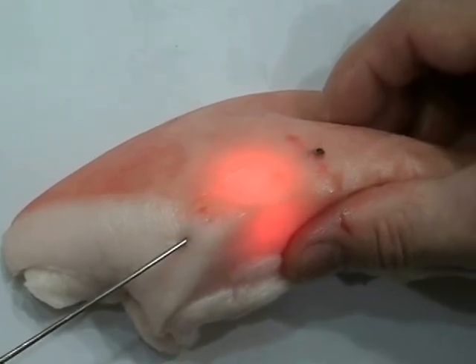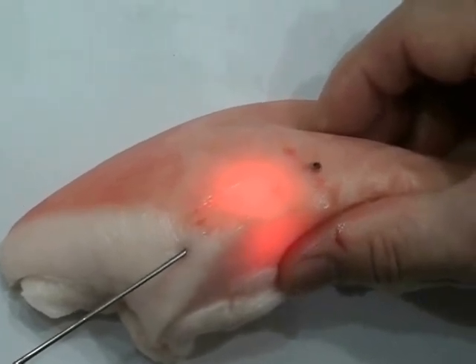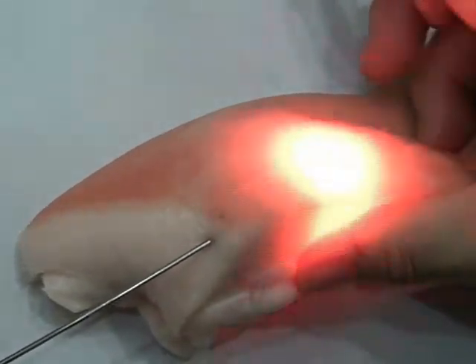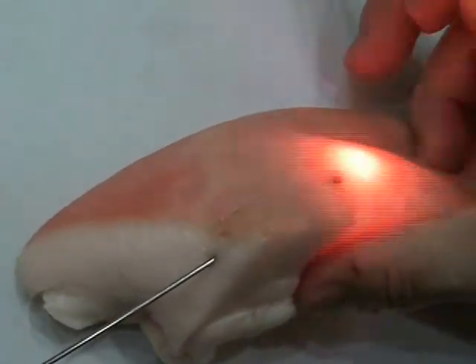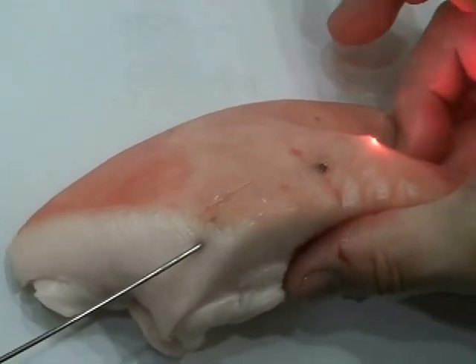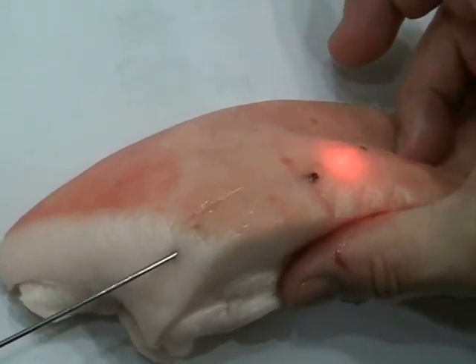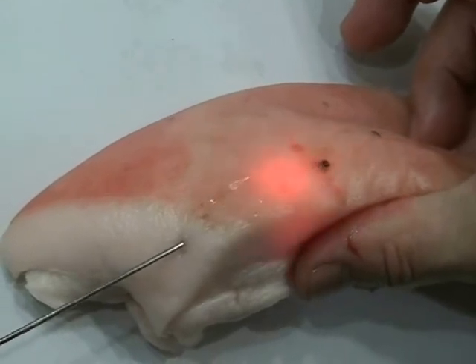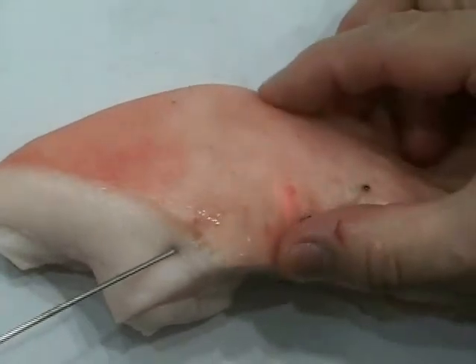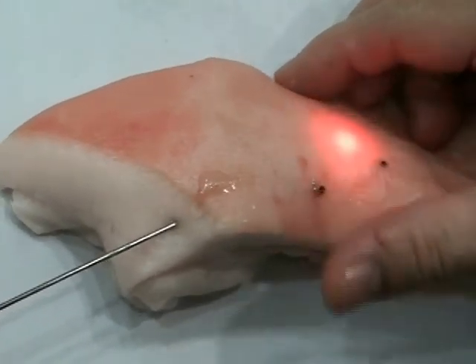If the operator moves the handpiece forward while emitting plasma light, the same as in the common laser lipolysis procedure, we are sure it burns the skin because of the very powerful energy. This time, we move the cannula forward with the exposed fiber emitting plasma light, melting down the fat first, and the cannula moves forward without resistance.